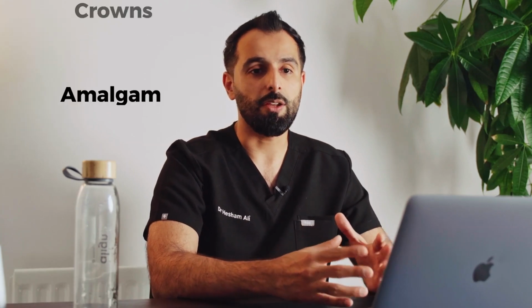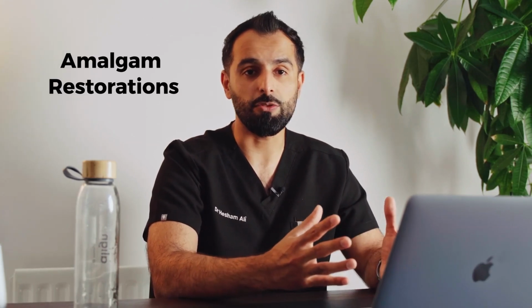So have a good look clinically and don't just go onto the online portal and forget about the clinical picture. You have to maybe refer to your photographs to remind yourself of the position of crowns, the position of any amalgam restorations which may affect your bonding surfaces. So have a good look at that to ensure you're not prescribing treatment or forgetting to prescribe approaches or aspects of your treatment which could be quite important.